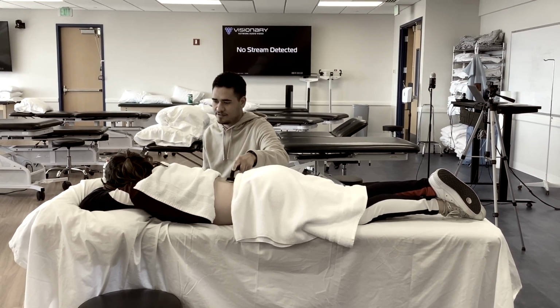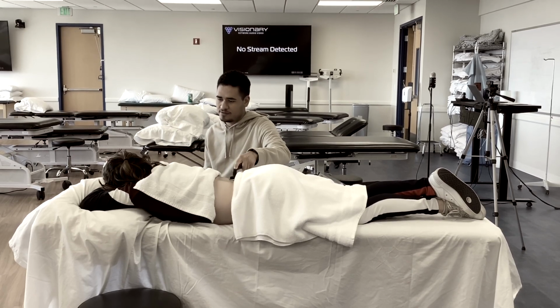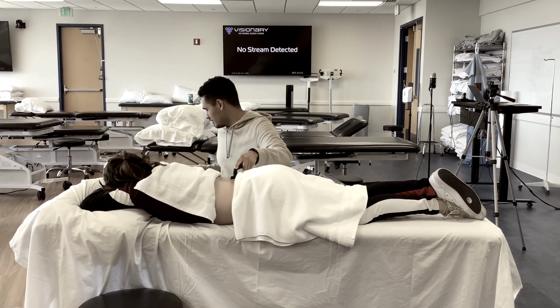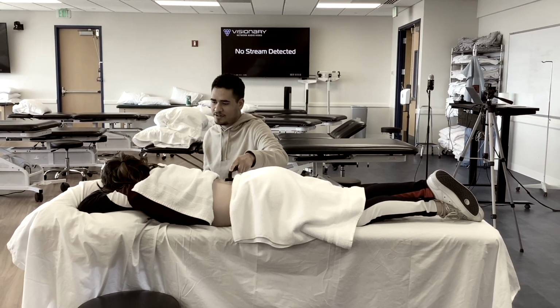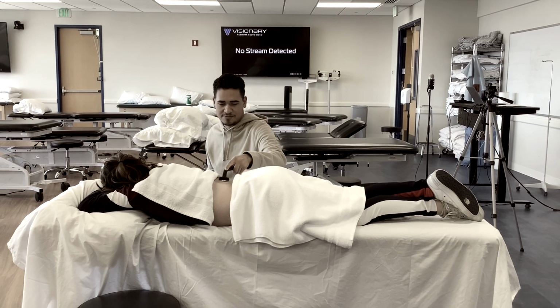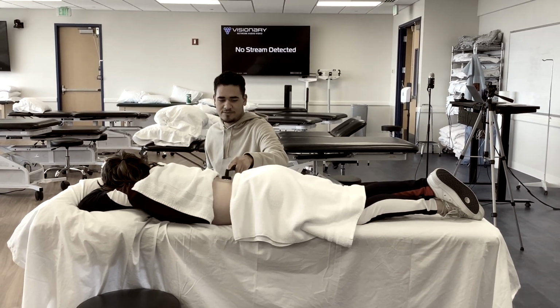All right, and then how does that feel? Feels good. Feel any heat yet? Not yet. All right, I'm just going to increase the intensity a little bit. How about now? Yeah, starting to feel it. Starting to feel some heat. All right, I'm just going to keep moving it and keep doing this.